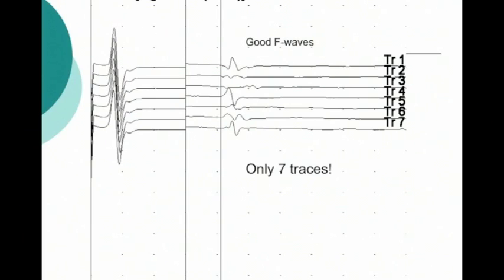I would be willing to bet that in this case, the patient was complaining about the stimulation and the technician stopped and figured that they could get a good enough response. If that happens, that's fine. But if you can go for the 10, go for the 10.